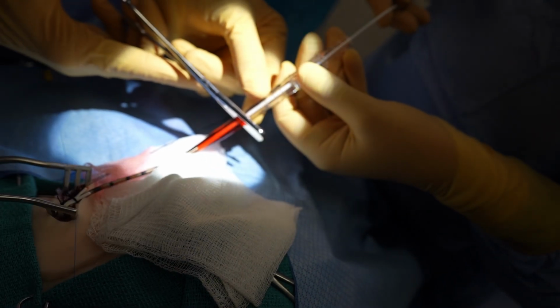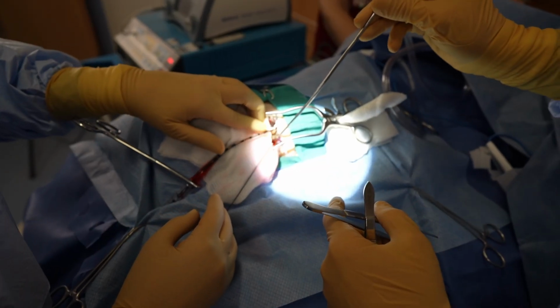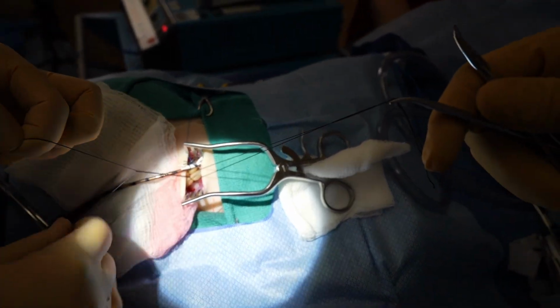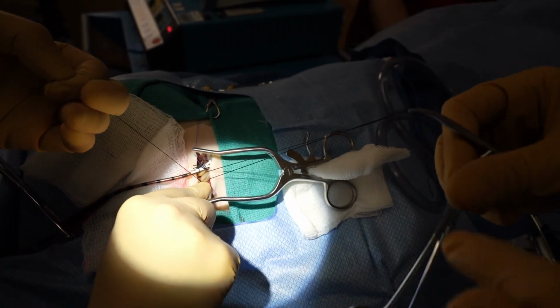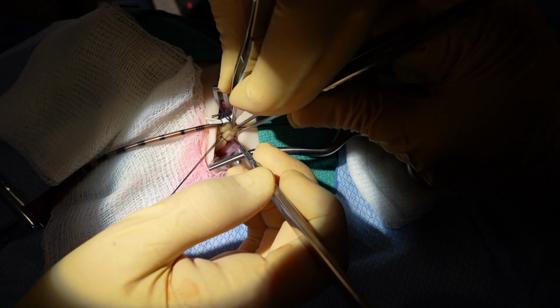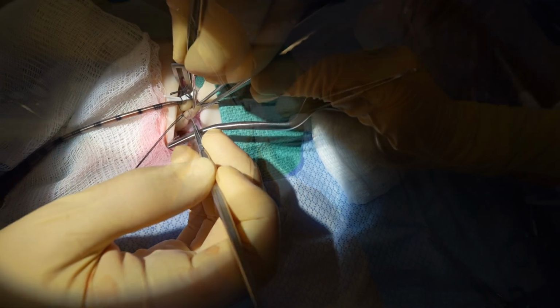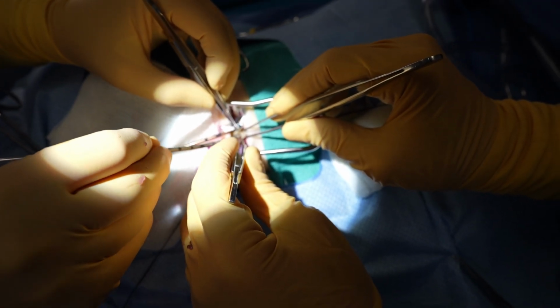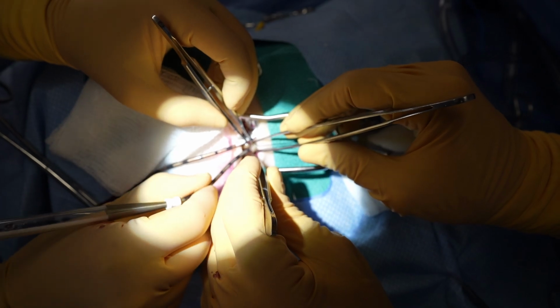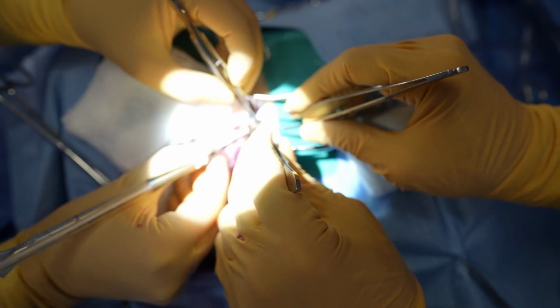Our assistant will place a tubing clamp on the clear portion of the cannula and avoid clamping down on the metal portion. Next, we place the venous cannula, first tying down the cephalic side and placing it on tension. We then control the cardiac side and perform a venotomy using an 11-blade going transversely across the vessel. Next, we obtain our cannula and place it down to our predetermined length, which is typically 6 to 7 centimeters in a neonate, or in a larger child, it will be the length that it takes to get the cannula down to nipple depth just to the right of the sternum.